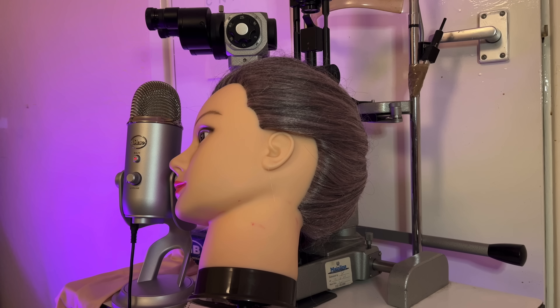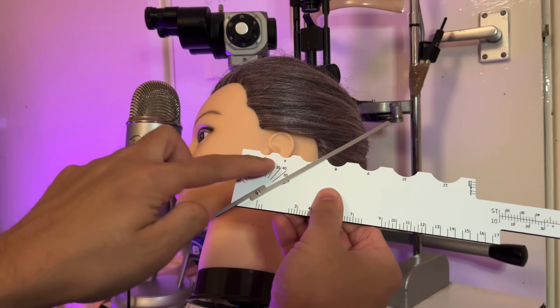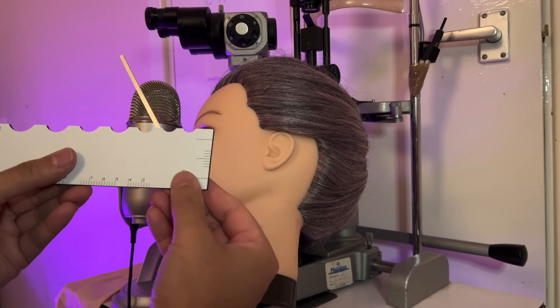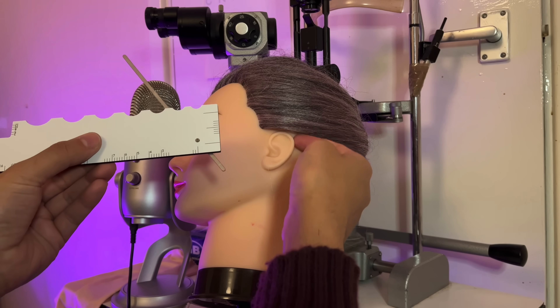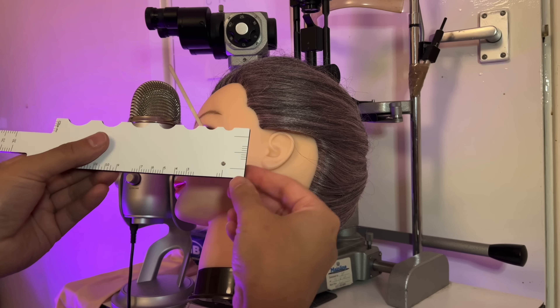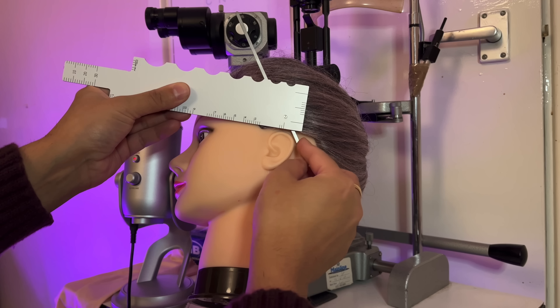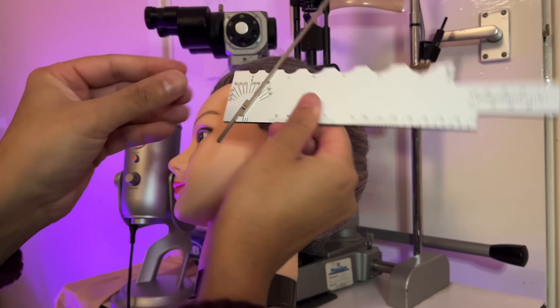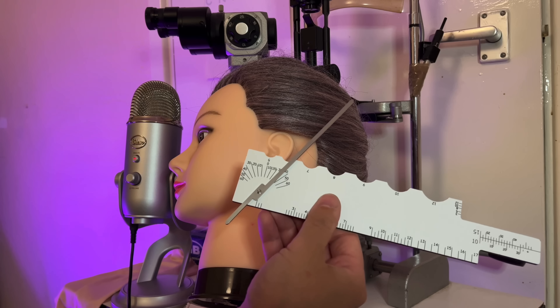Now we're going to do the downward angle of drop. Using the scale and cursor — usually you'd have to bring the ear forward — this will touch in the space between the mastoid and the inner part of the ear from behind. Place that there and bring the cursor behind the ear very gently. Flip around, take the angular measurement on the scale there, and repeat on the other side.